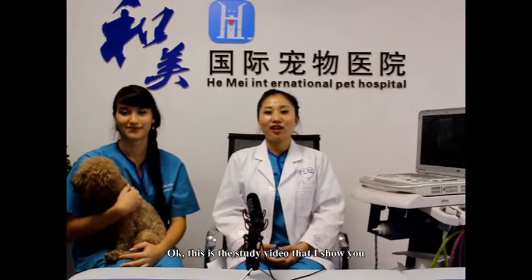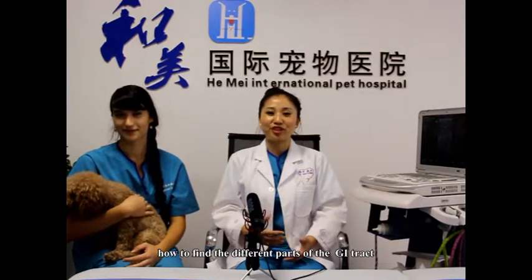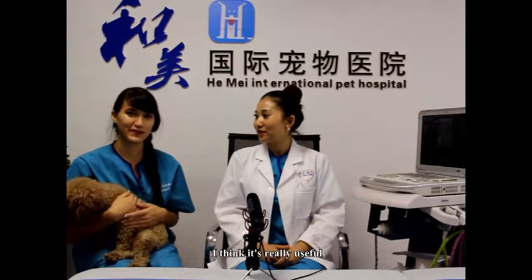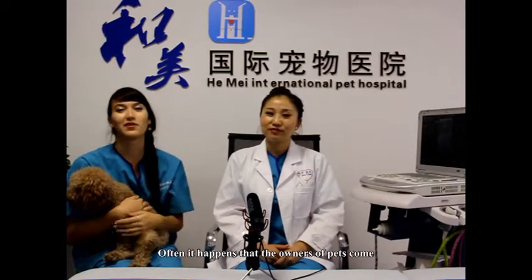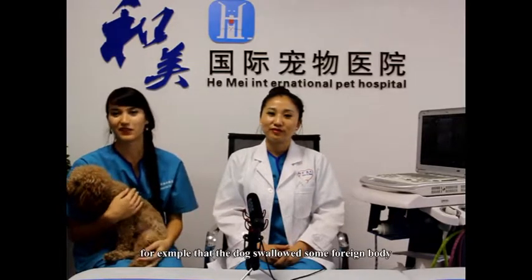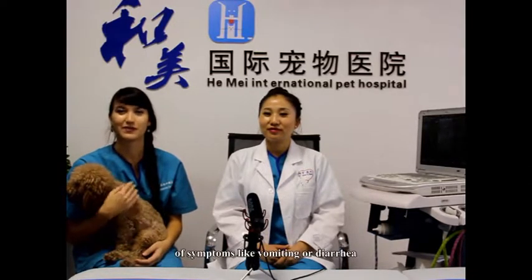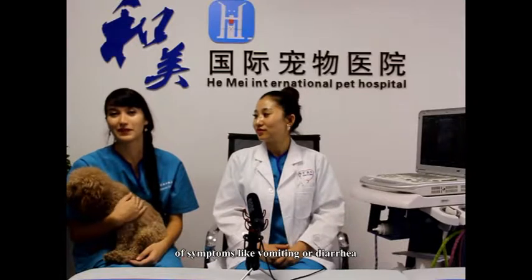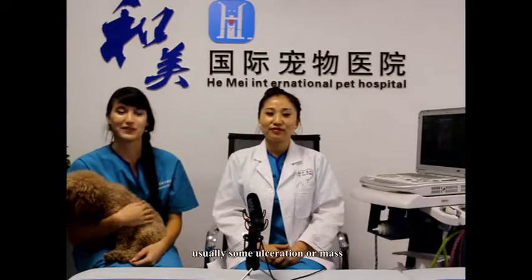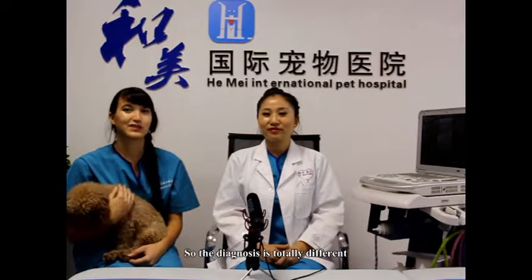Okay, this is the study video that shows you how to find the different parts of the GI tract. So what do you think about it? I think it's really useful. Often it happens that owners of pets come and they are convinced, for example, that the dog swallowed some foreign body, or they think they know the reason for symptoms like vomiting or diarrhea, but ultrasound shows us totally different results, usually some ulceration or mass. So the diagnosis is totally different.